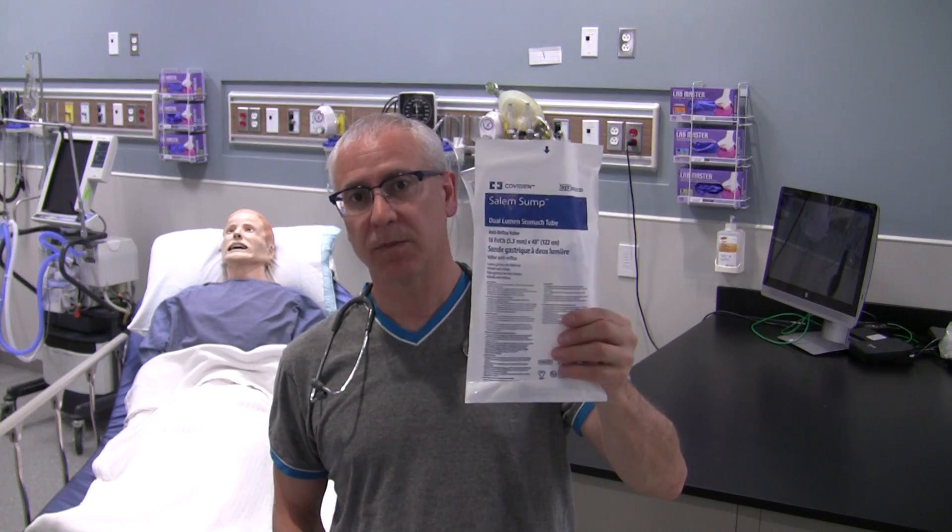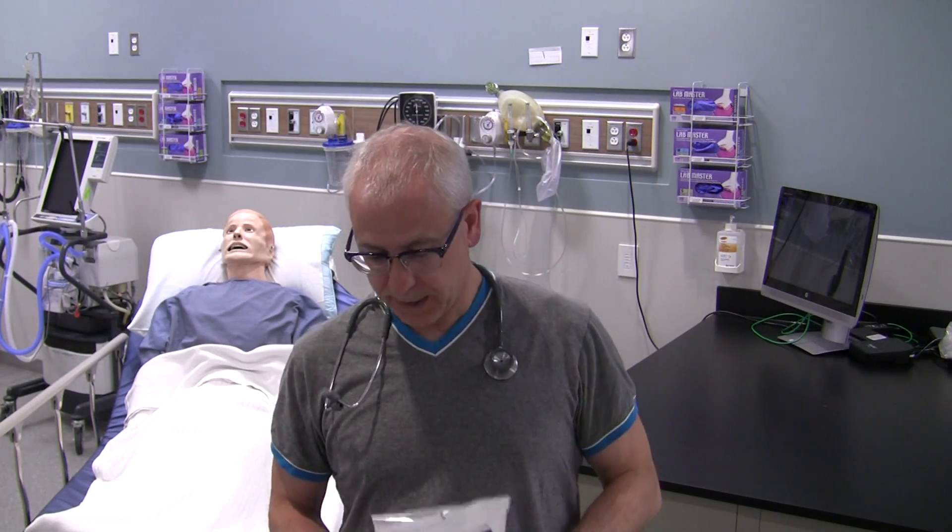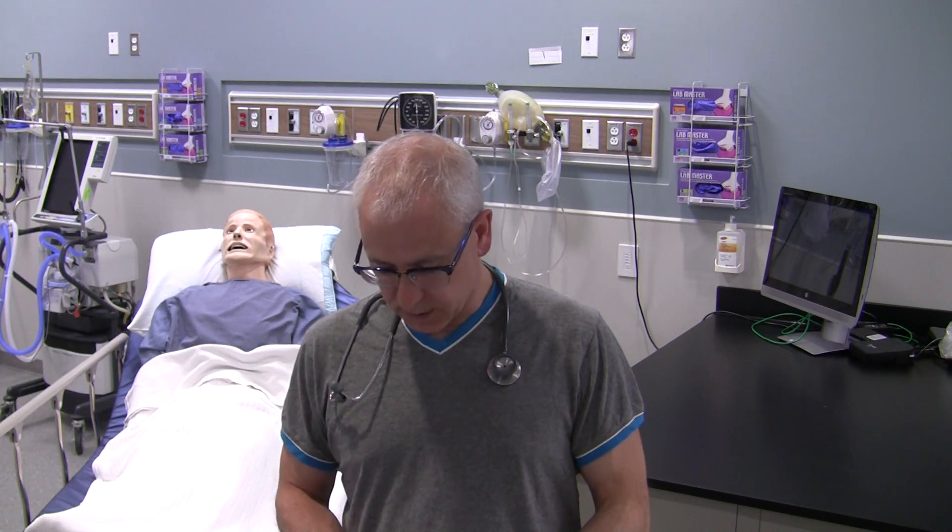You'll also need a nasal gastric tube. NG tubes are sized to the patient based on the width of the patient's external nares. Because you're going nasally, you have to insert it through one of the nostrils, so you need to size it to maximize the diameter without making the tube too large and uncomfortable for the patient. Grab whatever type of nasal gastric tube your region uses and prep it — I'll show you how to prep that.